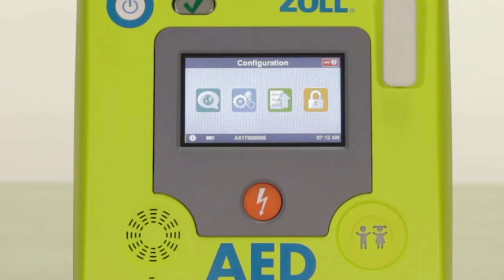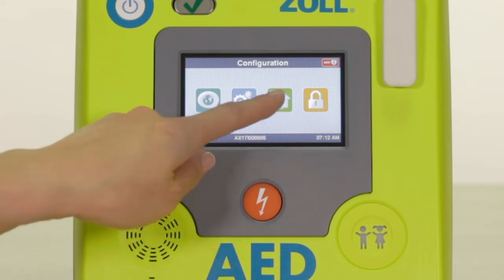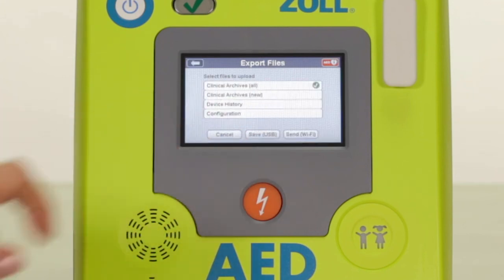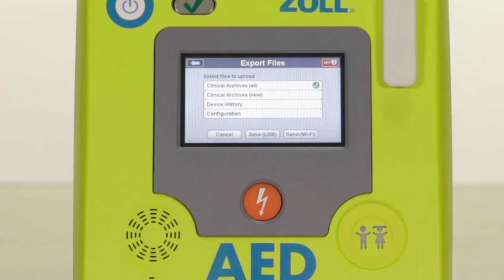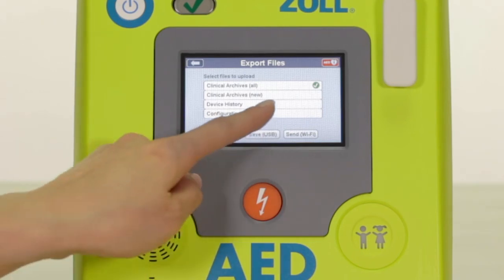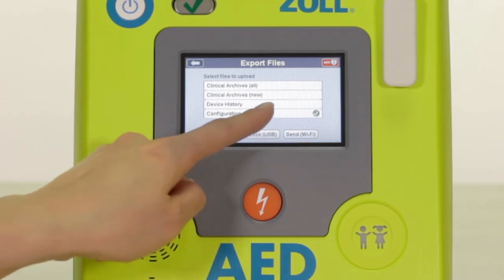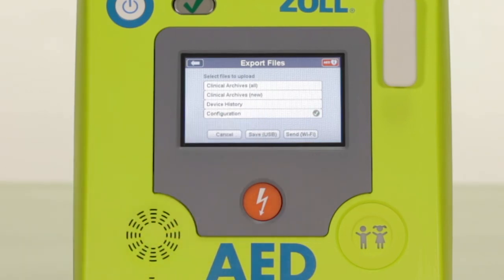When you might need to receive Xole technical support for a potential device issue, you can export the device history data from a Xole AED3. This file can be exported to a USB stick and then sent to Xole technical service, often allowing Xole to diagnose potential device issues without requiring you to return your Xole AED3.